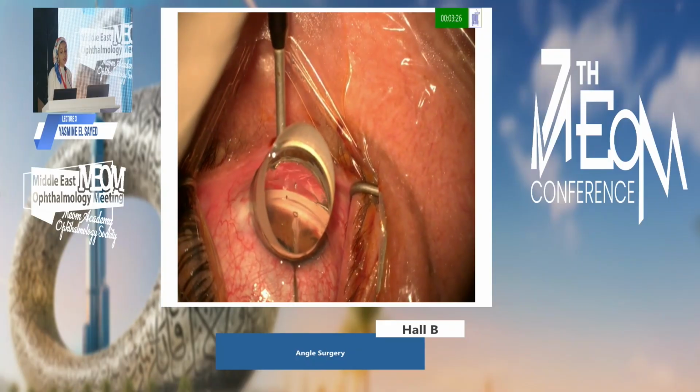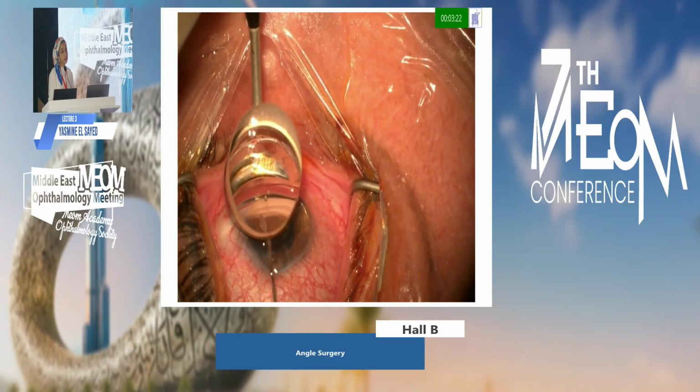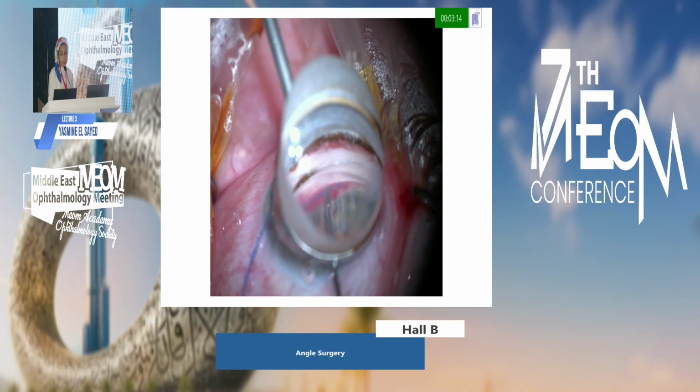The rule of thumb is to try to detect it in a timely manner. So you need to eyeball how far you've gone with your suture. If it's going on and on and on, you need to stop and address the misdirection.